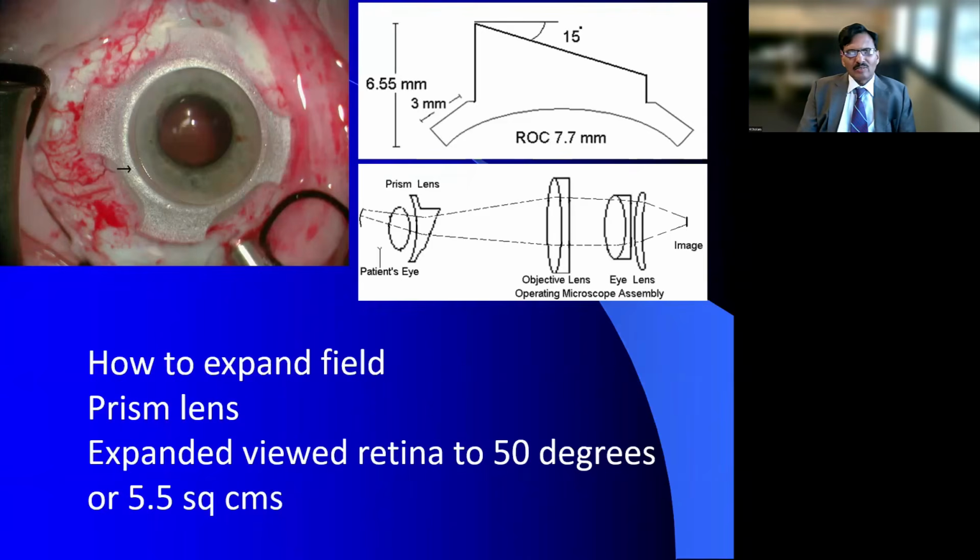So for example, you look at the inferior retina, then if you have to look at the temporal retina, for example in a left eye, you have to rotate it clockwise so you can get the temporal view. And so, with another 90 degrees rotation, you get the superior retina. This is cumbersome, not pleasant, but at least, in times when you want higher stereopsis in a particular area, this is a maneuver an experienced surgeon can use to visualize the retina.